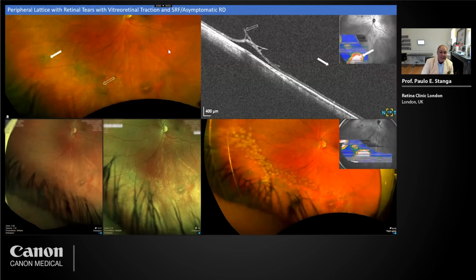And these are the imaging results of that patient, and you can see the progression of the subretinal fluid following her declining treatment a year ago, and we repeated the imaging and were able to carry out treatment a month and a half ago.